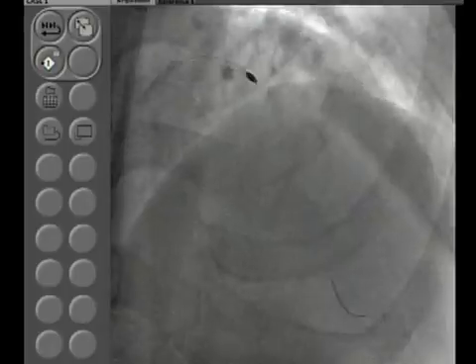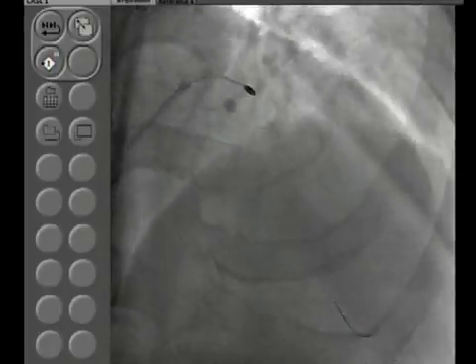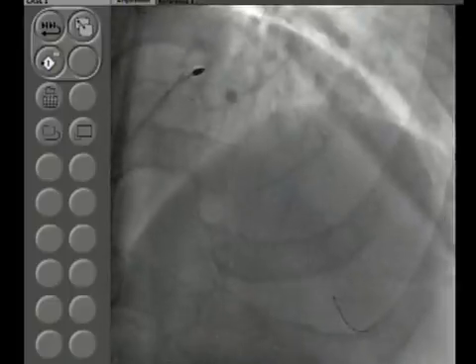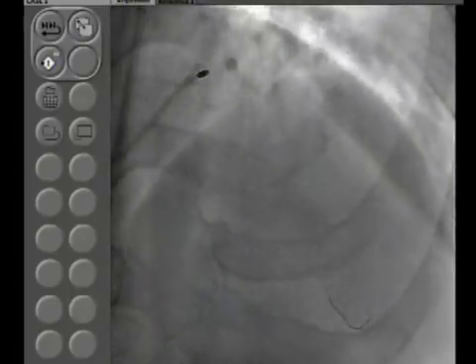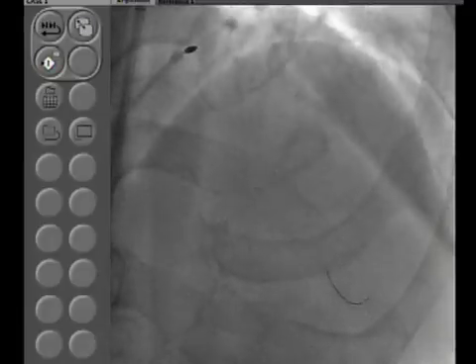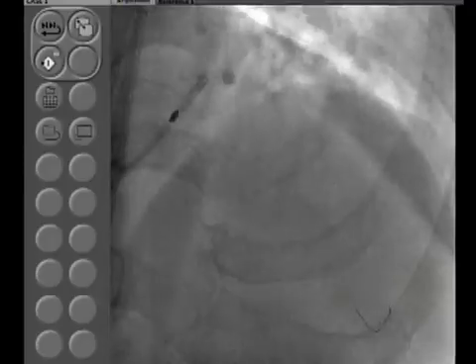Okay. Pull back. Fine. So now clearly we have done total ablation of about 3 minutes, and the burr did not go. Just 1 second. Make sure when you are ready to pull that your wire is straight, is not bent, because it's very likely to bend now. And we'll go with the 2.0 bar.